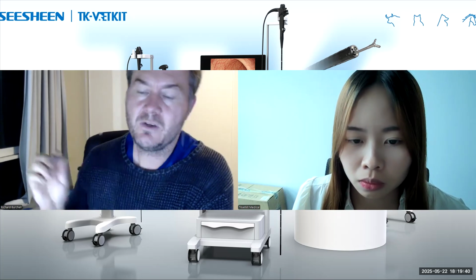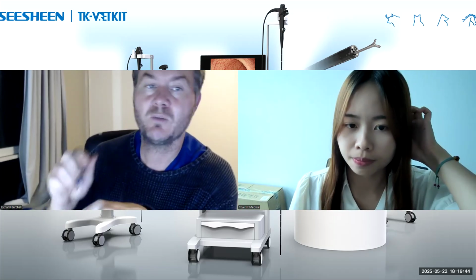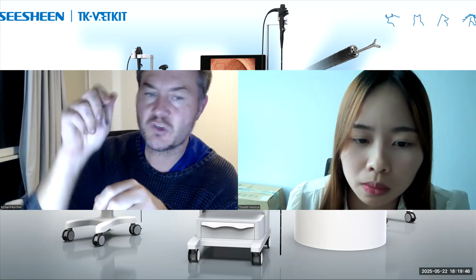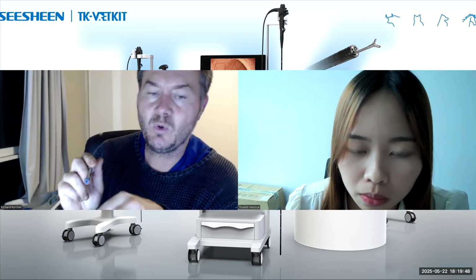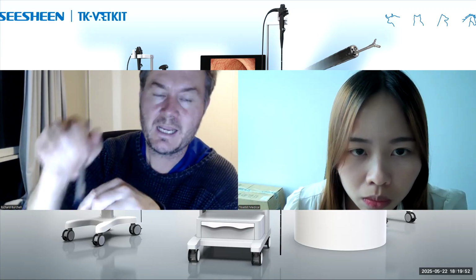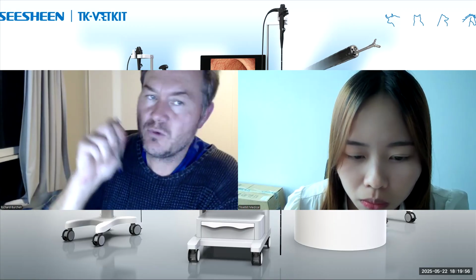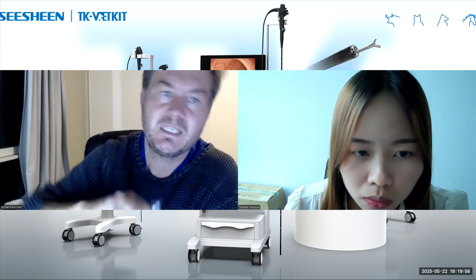Especially if you've got a brachycephalic dog or a dog in which you are accustomed to intubation being a bit difficult, your anesthetist or your vet nurse or whoever's doing it might push the scope in and not appreciate that there's a lesion there. So you scope and you can't see that because it's covered by the ET tube.